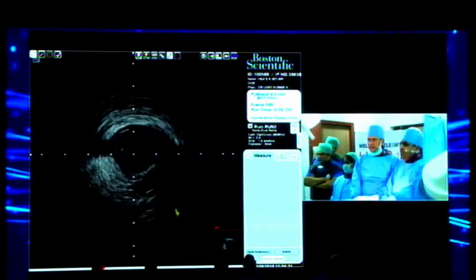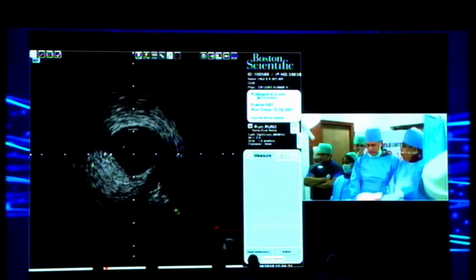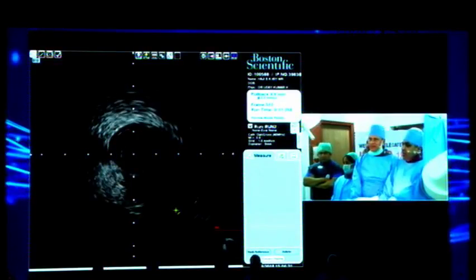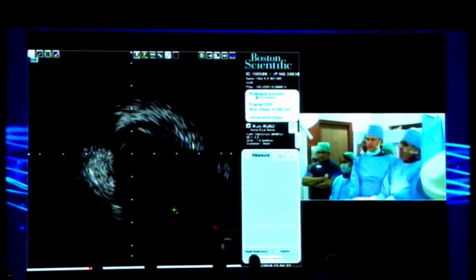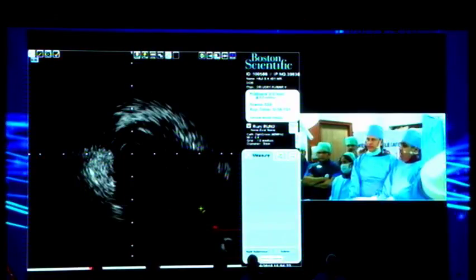Yeah, excellent. We discussed the same. But the patient was promised to be done, so already on the table, so we cannot change. We don't like to touch the septal again, because the septal usually needs 1 to 2 months to heal. That's why we chose IVUS guiding antegrade.